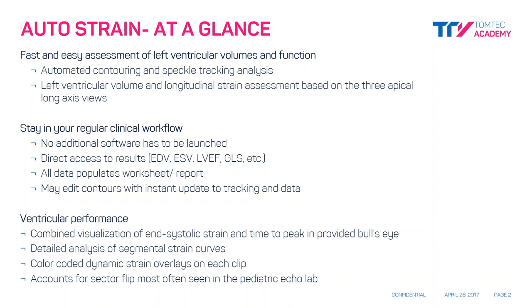AutoStrain provides fast and easy assessment of left ventricular volumes and function. By using the three apical views as a triplane analysis, or by selecting any of the three views, AutoStrain uses automated contour speckle tracking technology to provide both volumetric data and the global longitudinal strain. By staying in your clinical workflow, no additional software is necessary and access to AutoStrain is instant.